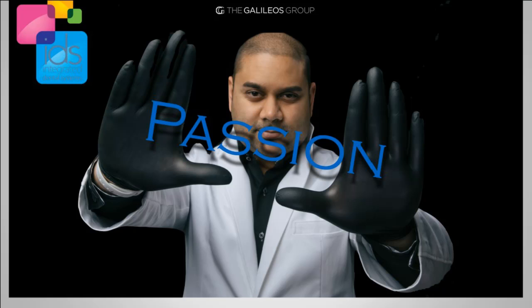Today, I'm going to be discussing CAD/CAM workflow for implant-supported restorations using the CEREC system.